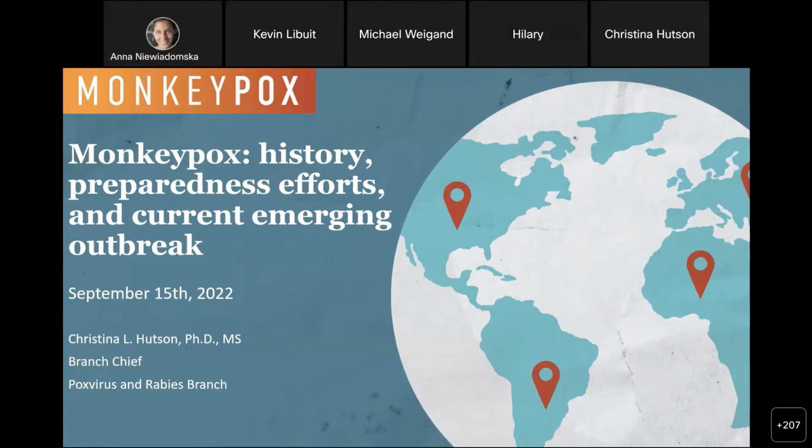We do have to get WHO approval every year for this work. It's validated by the WHO, and it has to have a direct human health impact. You can see that we have focused on vaccine-based assays, next generation vaccine development, antiviral therapeutics for smallpox, and then we actually have a small animal model, a humanized mouse model for smallpox.